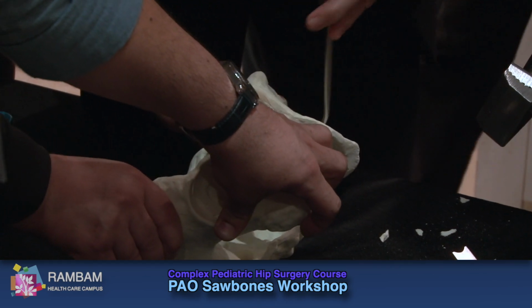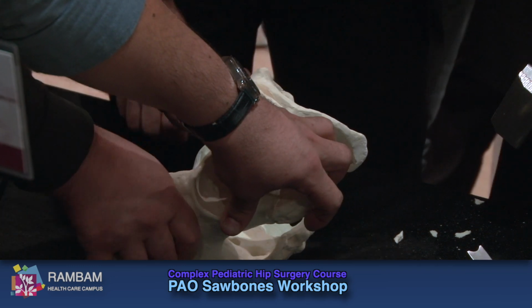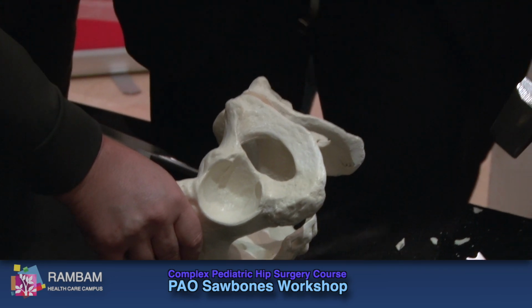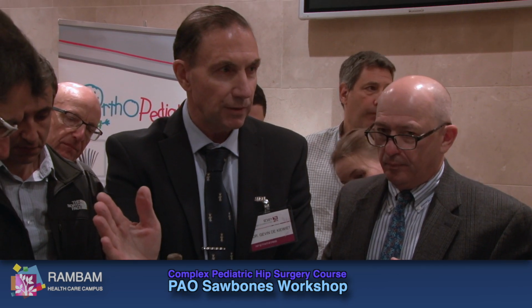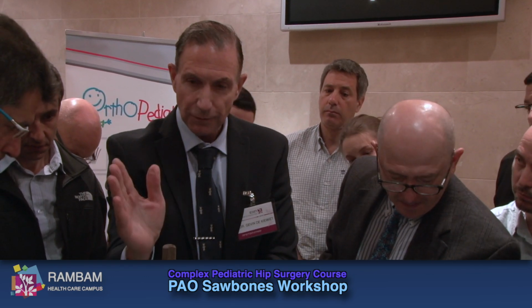Keep wiggling like this, so you can feel. Now at this stage, how you turn the beam: my beam goes to straight AP, then goes over there about 25 to 30 degrees, sometimes 40 degrees, depending on how much bowel gas you've got. The bowel gas will influence what you can see.